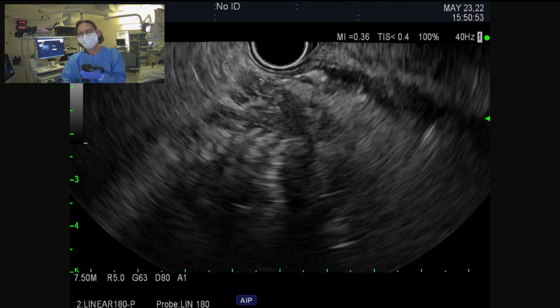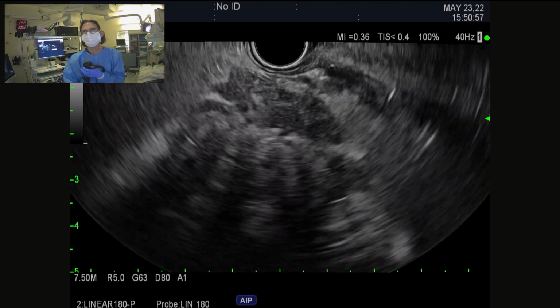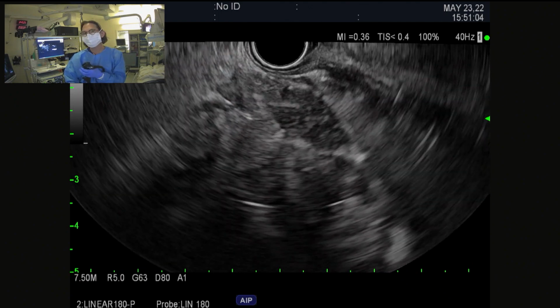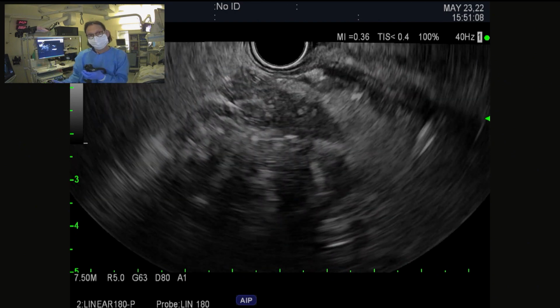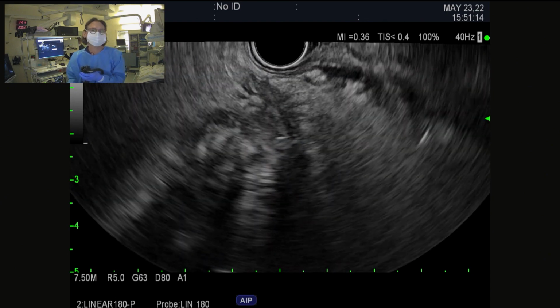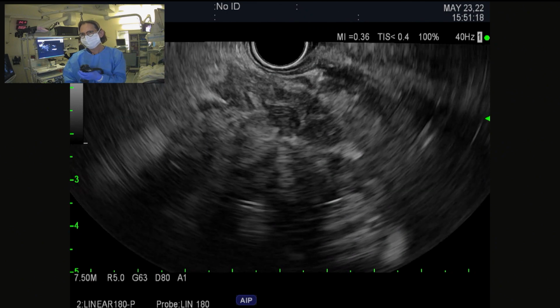In fact, I had told the nurses earlier I'd like them to irrigate now through the percutaneous drain so that I could see if we see some communication there. And of course, we could do it with fluoro. Now, I don't have lead on. We could all lead up. We're in the fluoro room. Usually, with rare exceptions, we don't need to use fluoroscopy, but we always have the ability to resort to it. If you inject, you're going to see bubbling right away, and you'll know you're in.